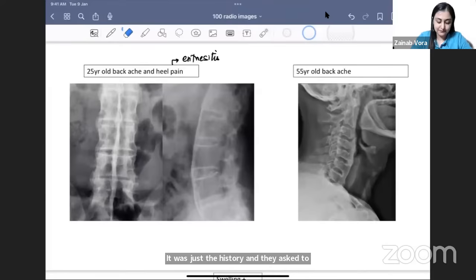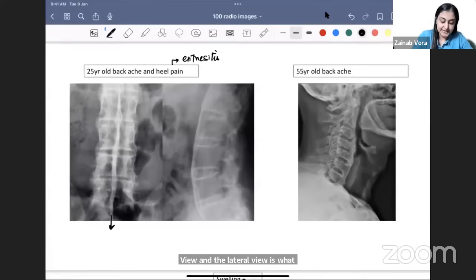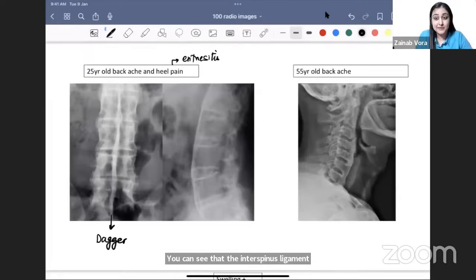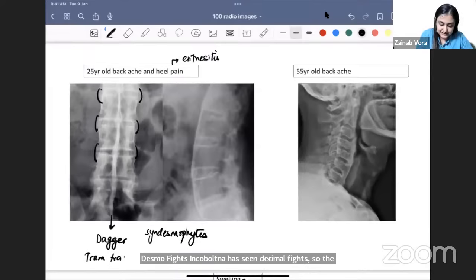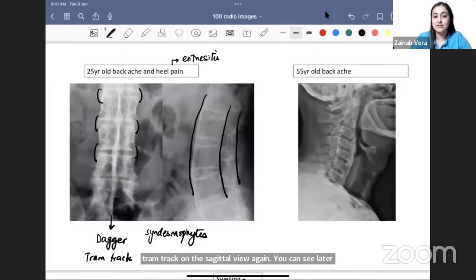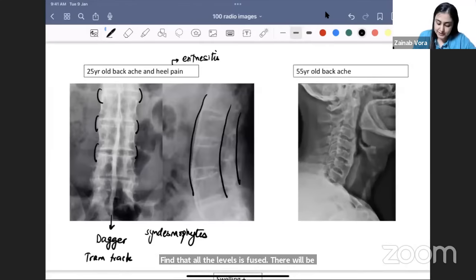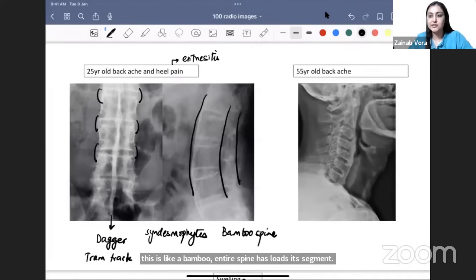On the AP view, you can see that the interspinous ligament is ossified — this image looks like a dagger. The interspinous ligament ossification and the complete spine fused by vertical syndesmophytes gives a railway track or tram track appearance on the sagittal view. On the lateral view, you can see how the complete spine at all levels is fused — very smoothly and symmetrically. This is the bamboo spine appearance, where the entire spine has lost its segmentation and become one long stick, reducing flexion and mobility.